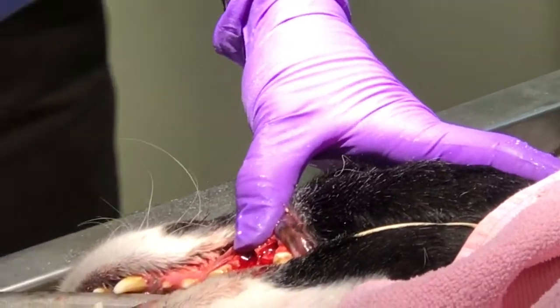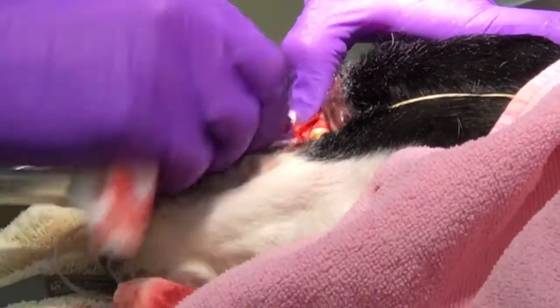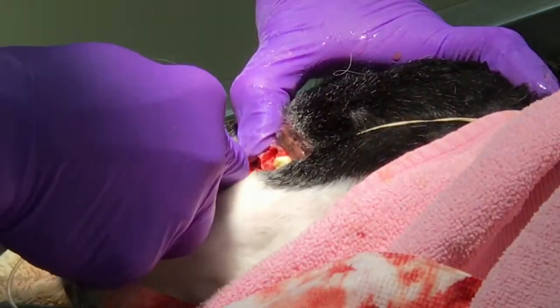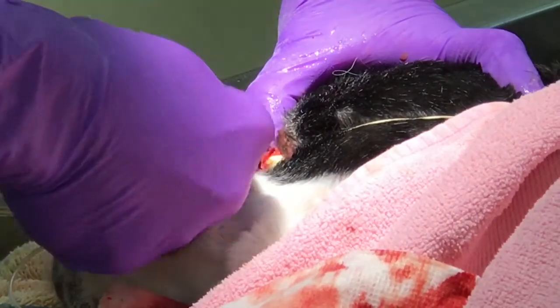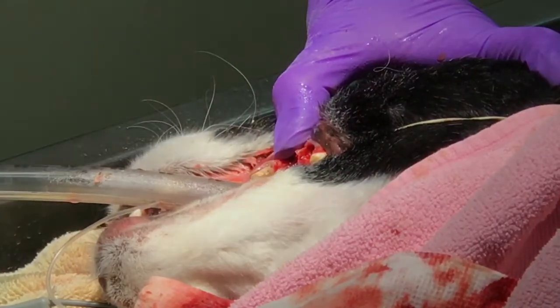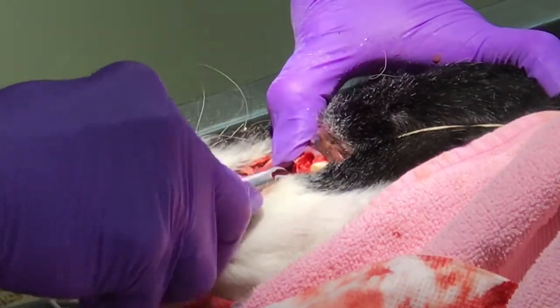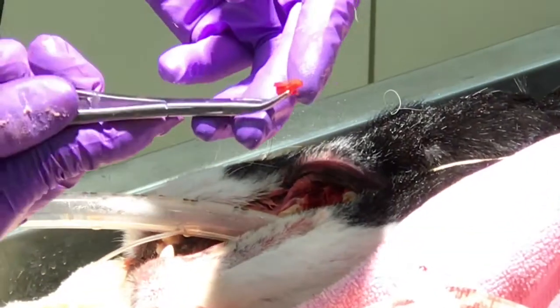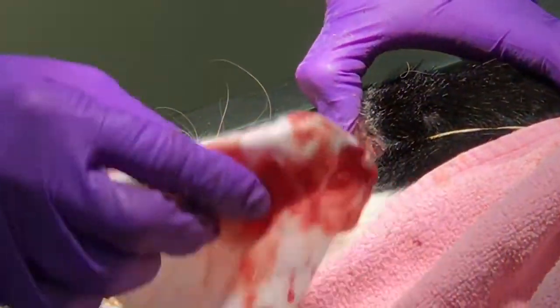Alright, so now we're down to the final root, which is also the most challenging of all three roots. Deep and encased in bone. And there we are, the final one. So there's the three-rooted extraction.